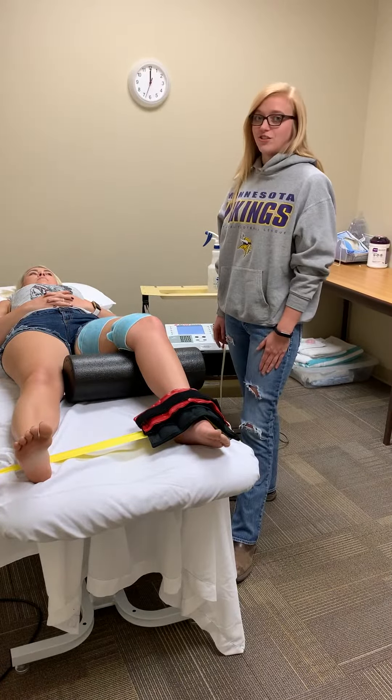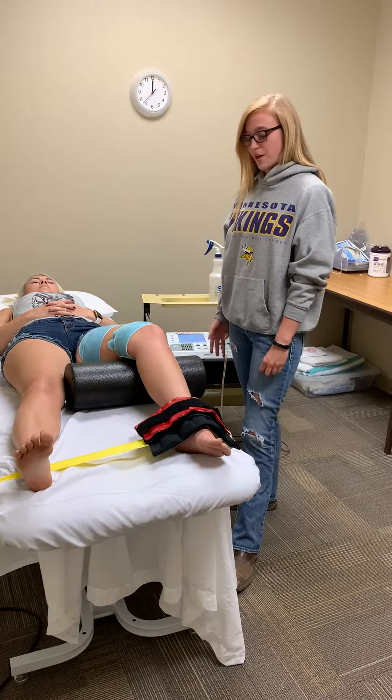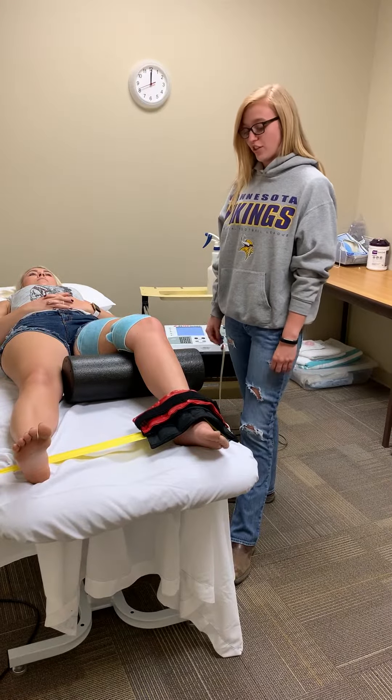Some contraindications for this — we want to screen for those first, so making sure she's not pregnant or has a pacemaker. We're using this therapy today to help strengthen her quad.